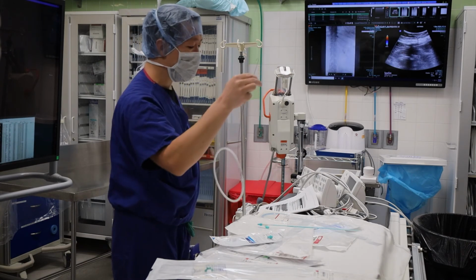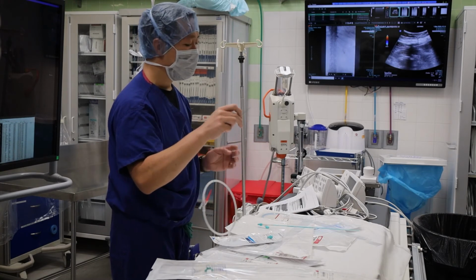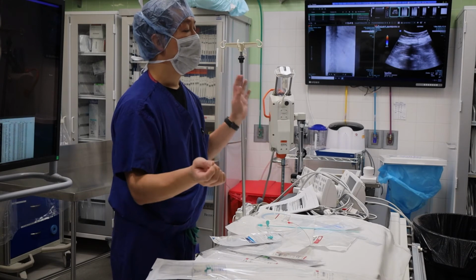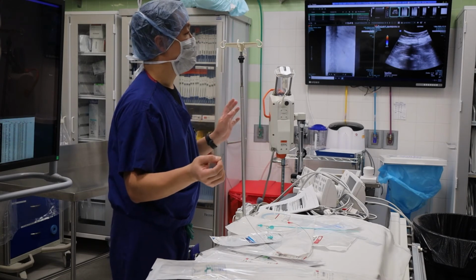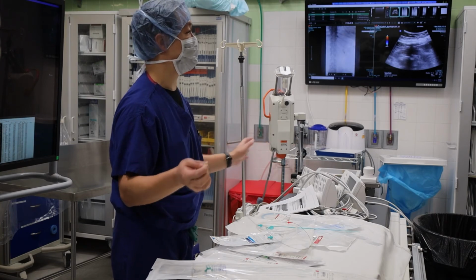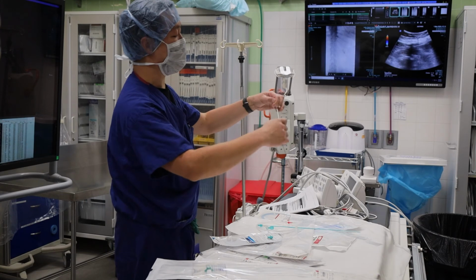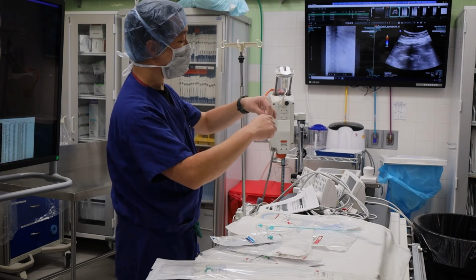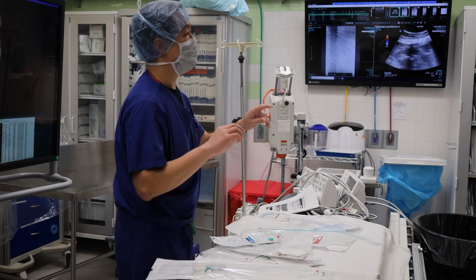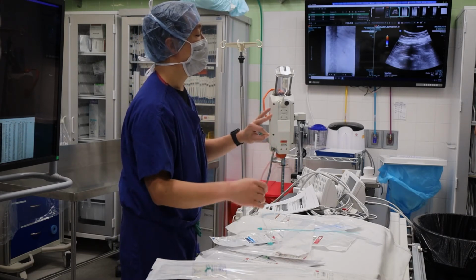Okay, so one word of advice on pin pulling, which everybody's doing: when this is in the body and somebody is taking out something, once you pin pull, please ask, do you have the wire, before you continue pulling the rest of it? Right, so this is out, like you pulled this thing out, let's just say, before you continue pulling it the rest of the way. Dr. Chan, do you have the wire? Okay, so now I grab it at the skin. Yes, I've got the wire, and then people wipe or do whatever.